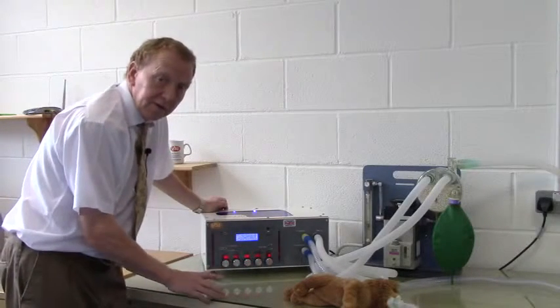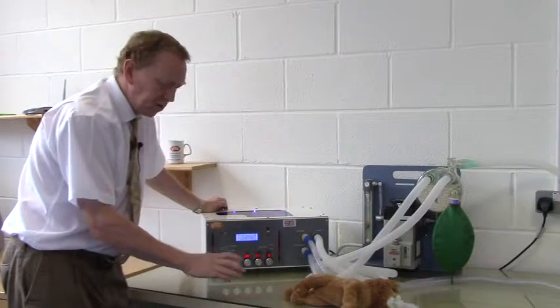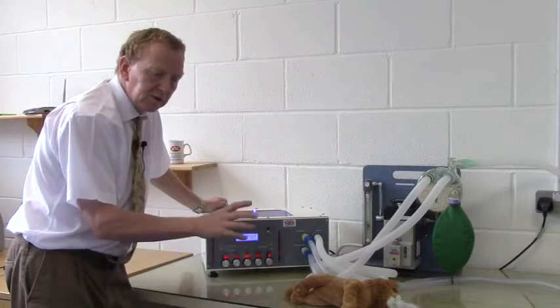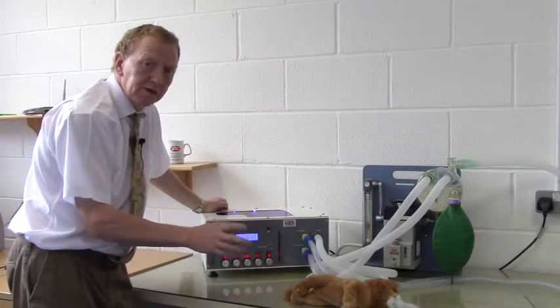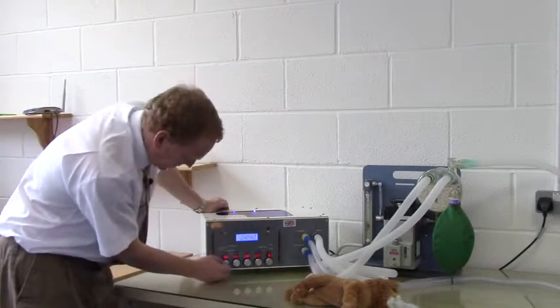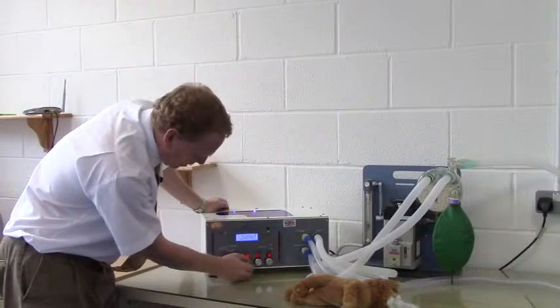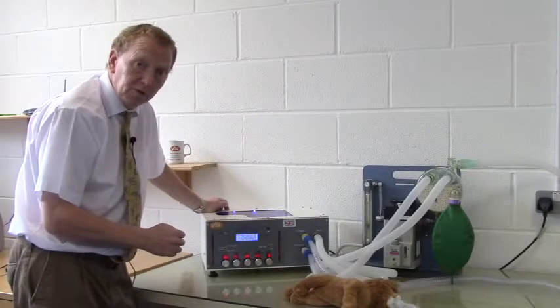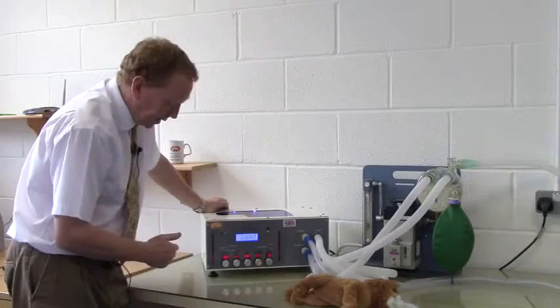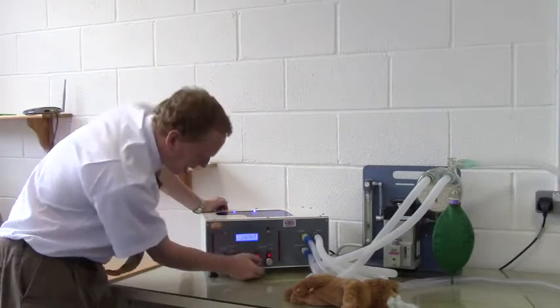The very rough calculation is that 6 litres a minute is 100 mils per second. You'll recall that Leo had a tidal volume of between 150 and 200 mils, so we want to deliver that in about a second, which means we want to set our flow rate somewhere between 8 and 12 litres a minute. So we'll set this to 10 litres a minute, and our expiratory time will remain the same as it was before, because we have roughly an inspiratory time of 1 second and expiratory 2.8. But this time our maximum airway pressure has become our target, and so we set this to 12.